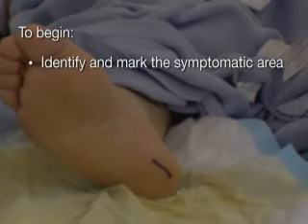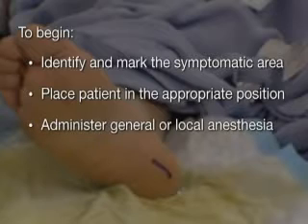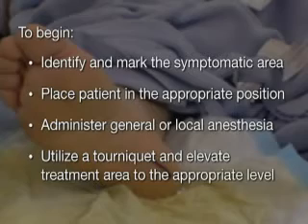To begin, identify and mark the symptomatic area while the patient is still alert. Place the patient in the appropriate position. Administer general or local anesthesia as indicated. Utilize a tourniquet and elevate the treatment area to the appropriate level.